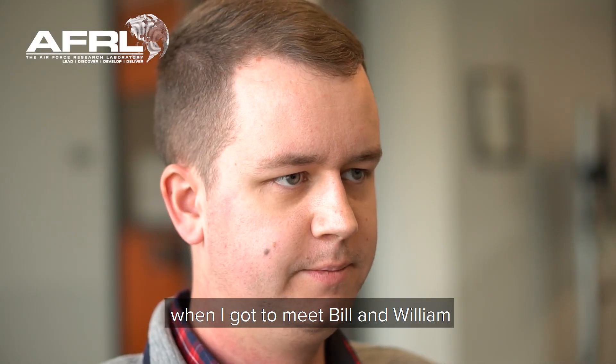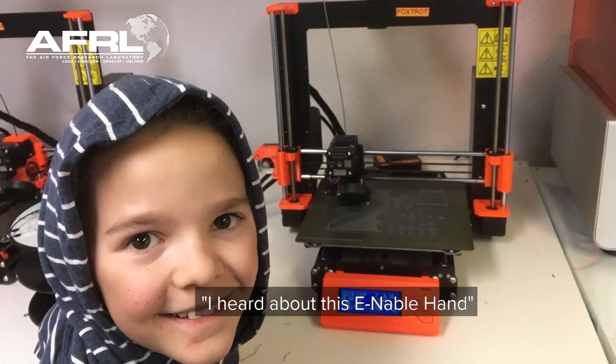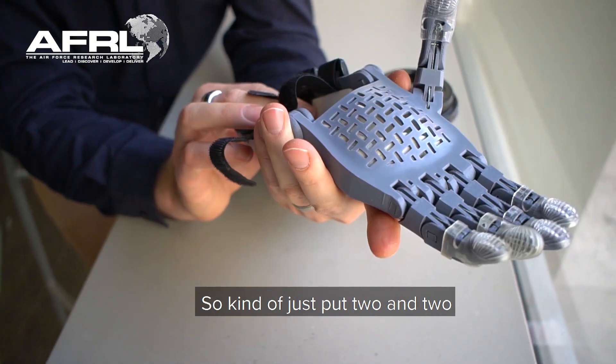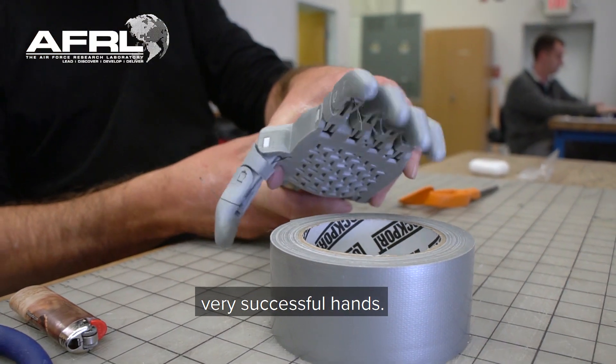It was really exciting when I got to meet Bill and William randomly on a Saturday. He came in and was like, you know, I'd heard about this Enable hand, and I was like, I've printed off several of these different styles and formats. So I kind of just put two and two together and we were able to print off some very successful hands.